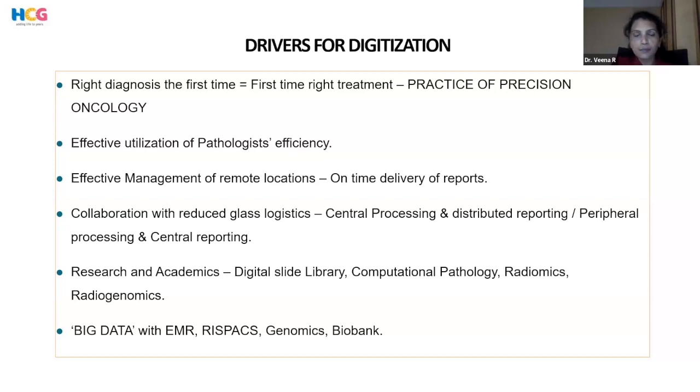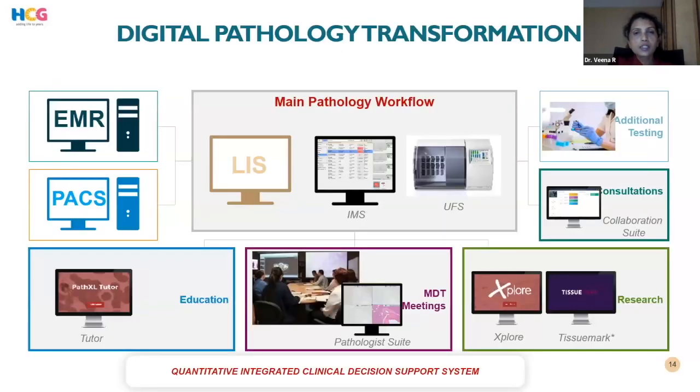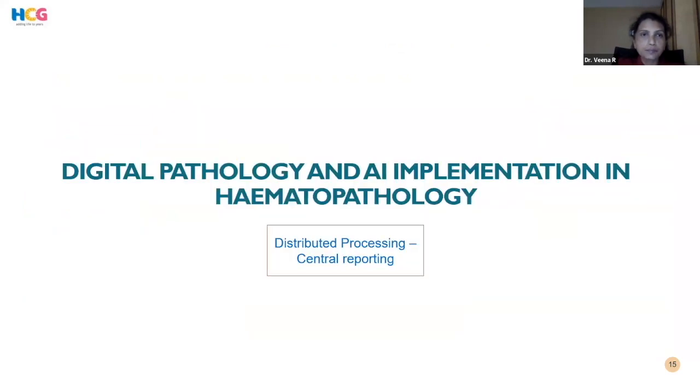So these were some of the drivers for digitization. So this is what I said, big data. We have electronic medical records, the PACS, radiology, and then education, MDT meetings, and then research and collaboration, and the molecular and genomics data. So everything on one desk or one screen. This is what we were looking at.